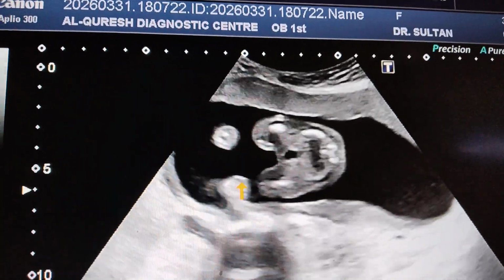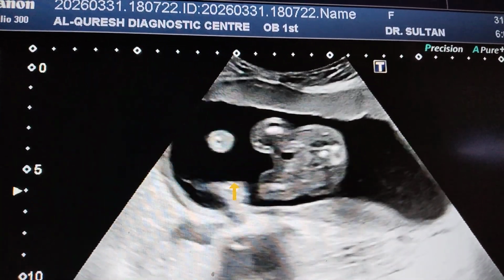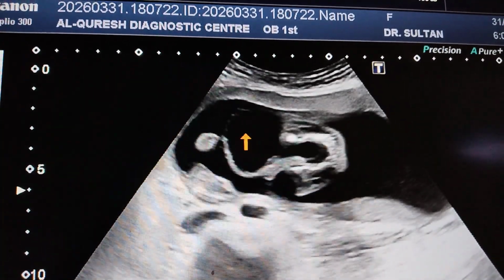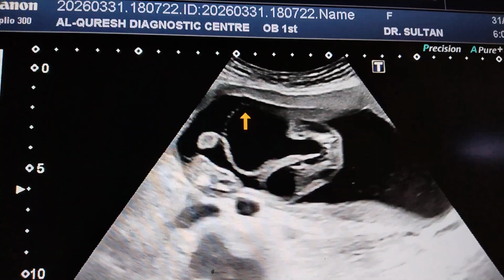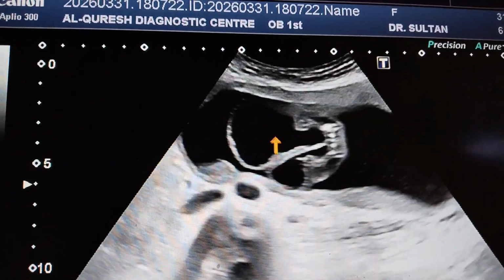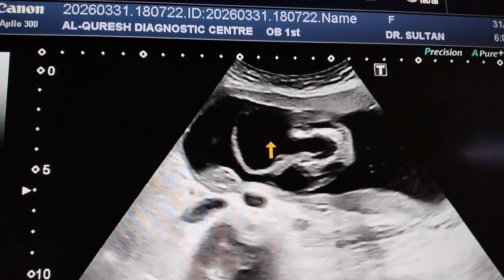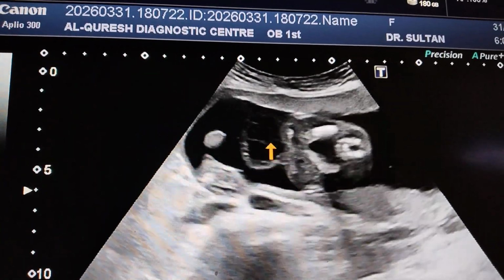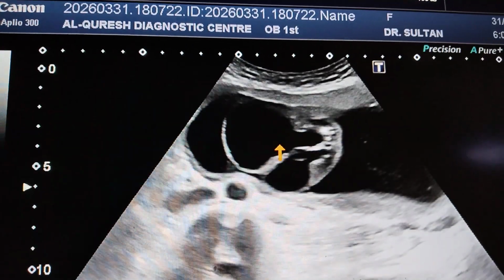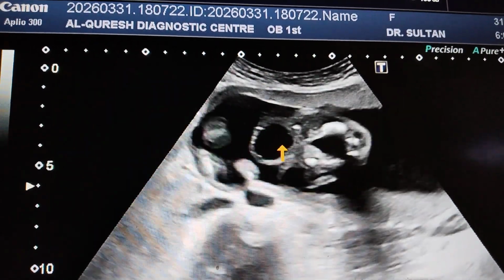While I am doing the general survey, I find this cystic area or cystic lesion that is present just at the level of the pelvic region.